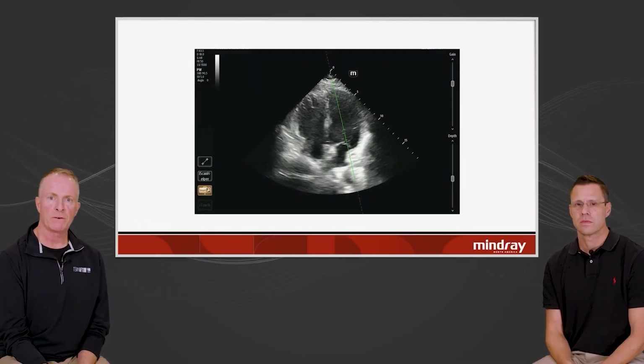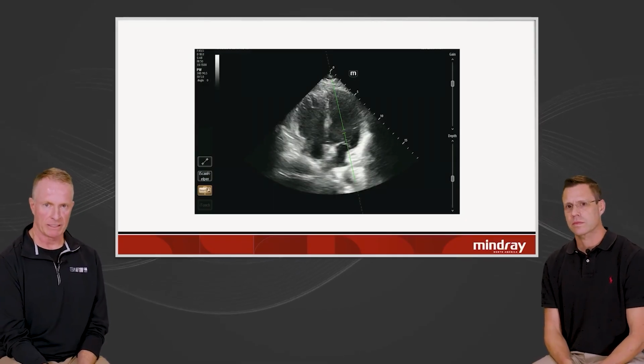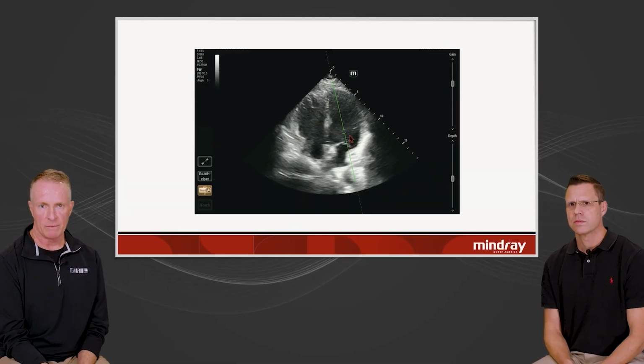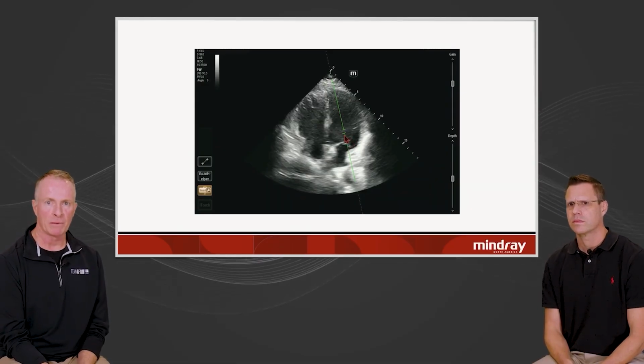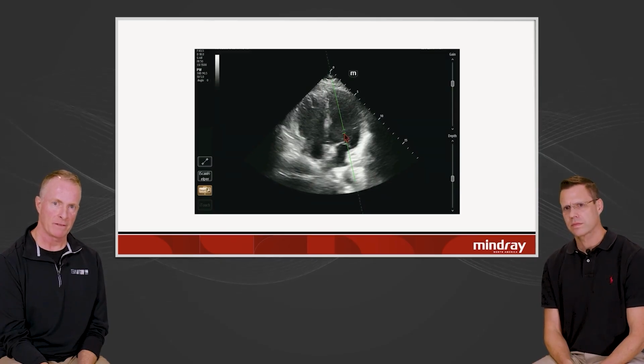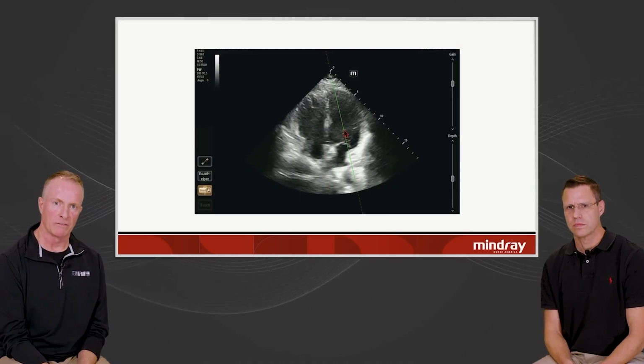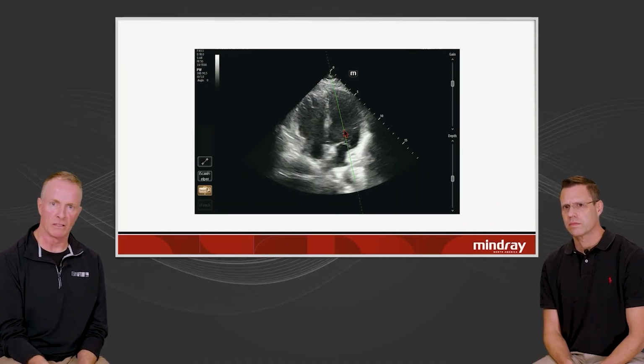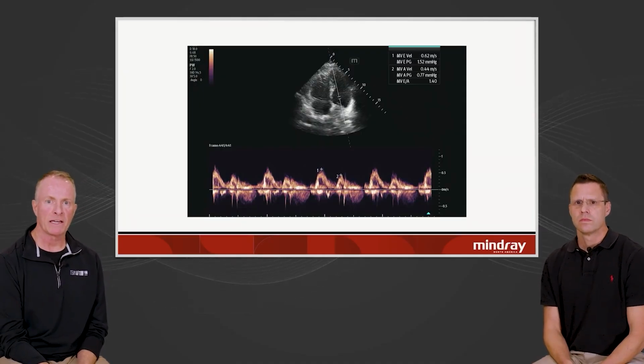So the difference between pulse Doppler and continuous wave Doppler, at least one difference, is that when you pull up pulse Doppler, the machine is measuring the flow of blood right at that gate. And that's important because that's just inside, in this case, just inside the mitral valve, and it's going to show you the mitral inflow. And that's in contrast to continuous wave Doppler, where it measures all along that line, which you don't want to use in this case. So you get something like this.